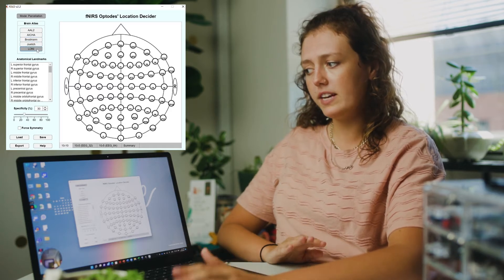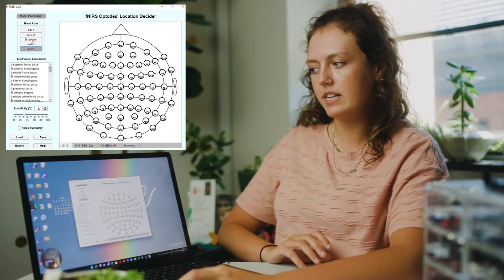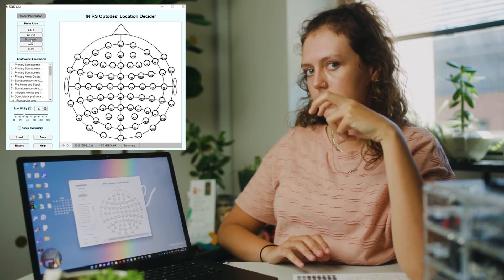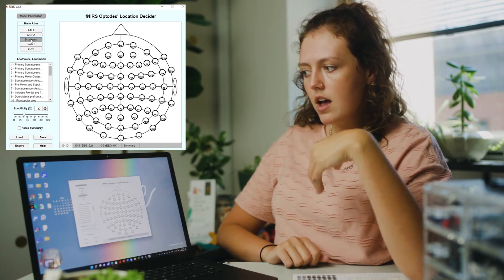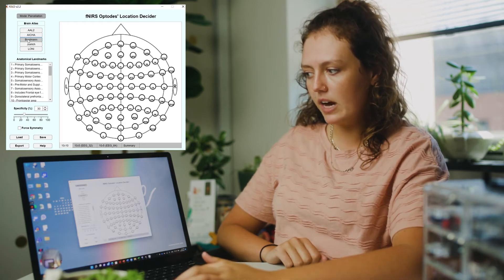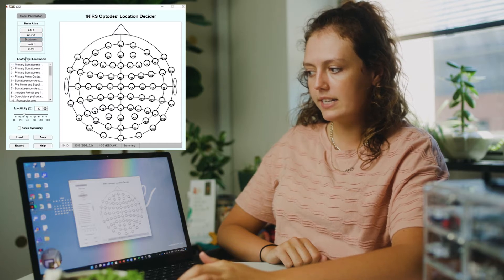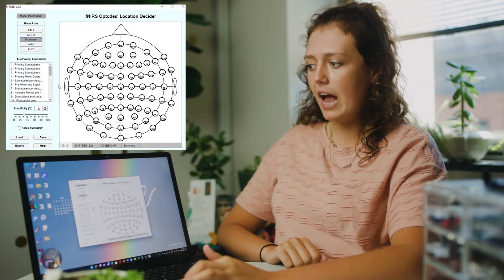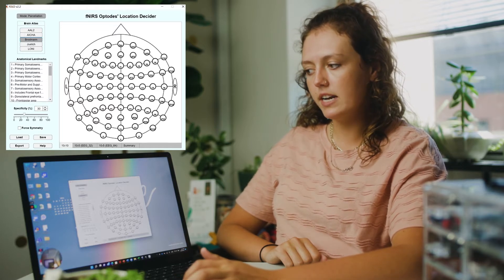For the example I'm going to show today, I'm going to use Brodman's area because I'm interested in some of those dorsolateral and frontal polar areas of the prefrontal cortex. As you can see, when you click on one of the atlases, there's a little box here and it shows the anatomical landmarks. I'm going to choose the landmarks that I'm interested in for my study.